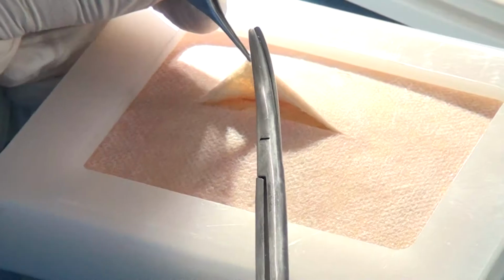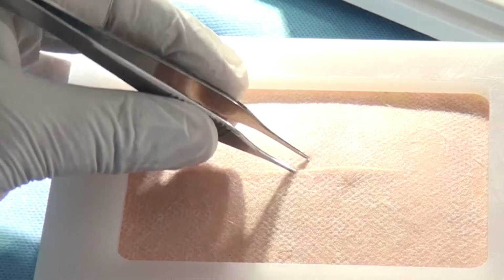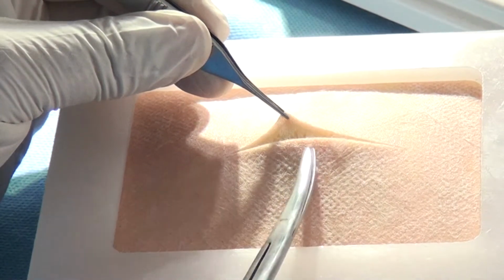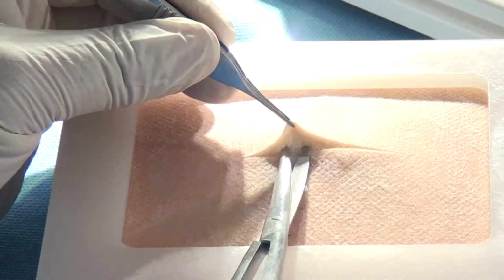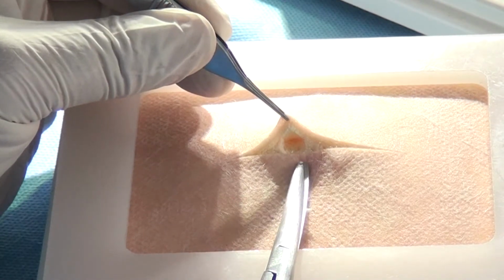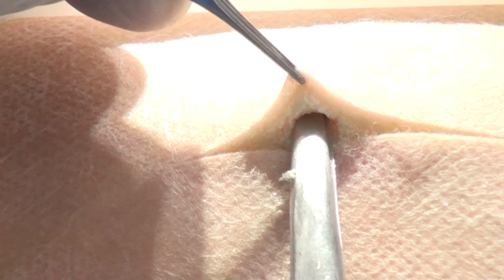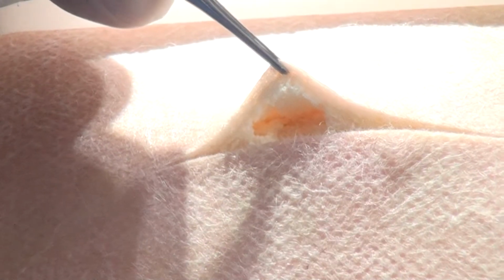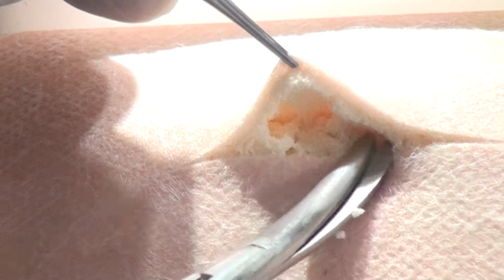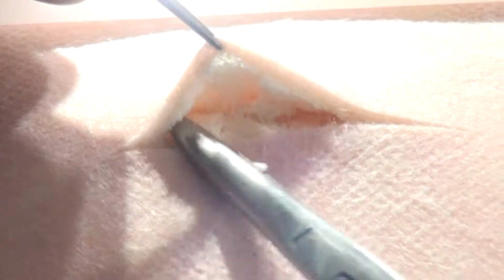That's why the curved scissors is also called dissecting scissors. I'll show you at the other end, where one end has been raised by scissors or blade, and this end you will see will be raised by scissors. Now I think you can see better. Look, this has not yet been raised. Keep looking at the screen, please. I'll make a cut. I've made it. You can see the cut here. And I'll take the convex part up, and I can spread it. That creates a space. And I'll again find some space to work on. I'll make a cut and spread it.